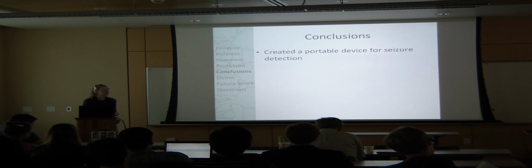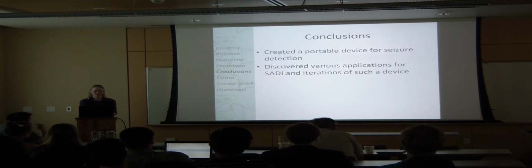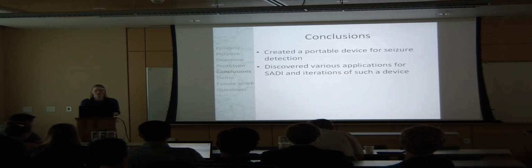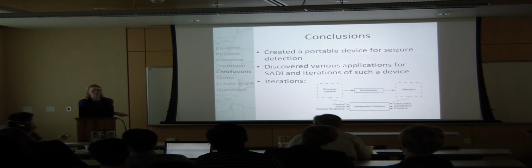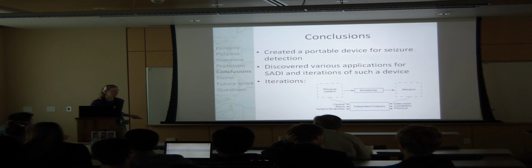So in conclusion, I was able to create a portable device for seizure detection, and I also discovered that there were various other applications for a device like SADI, and for iterations of such a device, and by iterations I mean something more like this. If you have a physical system, you can monitor the system with other types of sensors, not just something on the body.